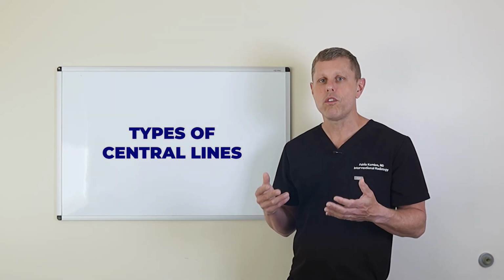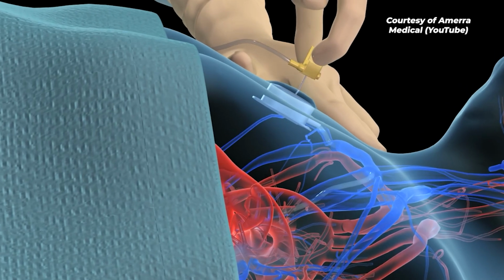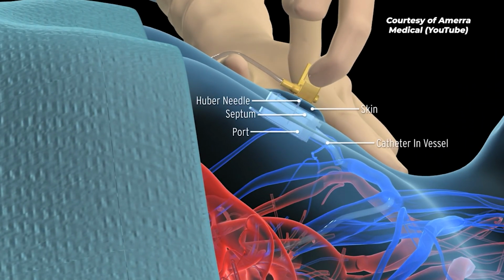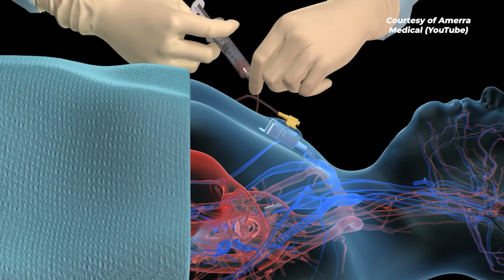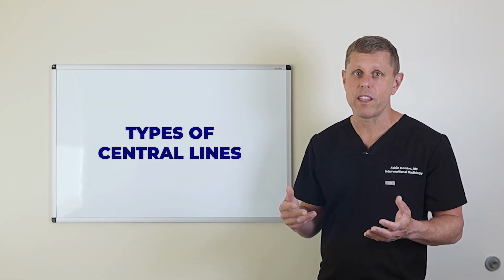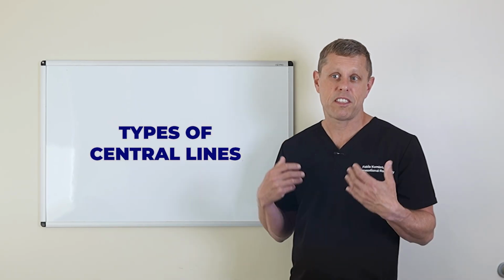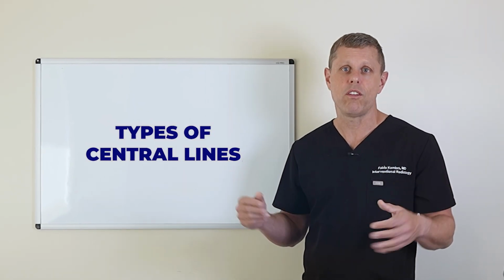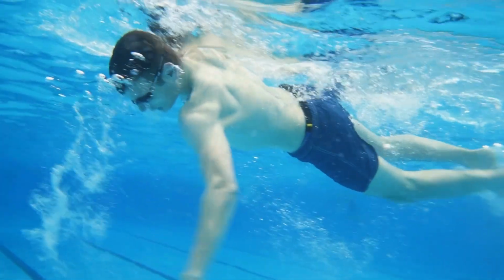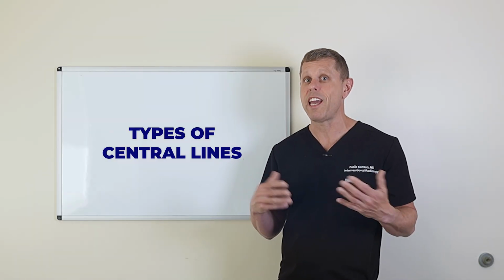So when you need to use a Mediport, what we do is you get a needle and you puncture the skin into that little container, that little reservoir, and then you can draw blood or infuse medication or chemotherapy, for example. The main advantage of the Mediport is that when you're not using it, you don't have any tubes hanging out, and you can go ahead and swim and play golf, do your normal activities, and you don't have anything hanging out.